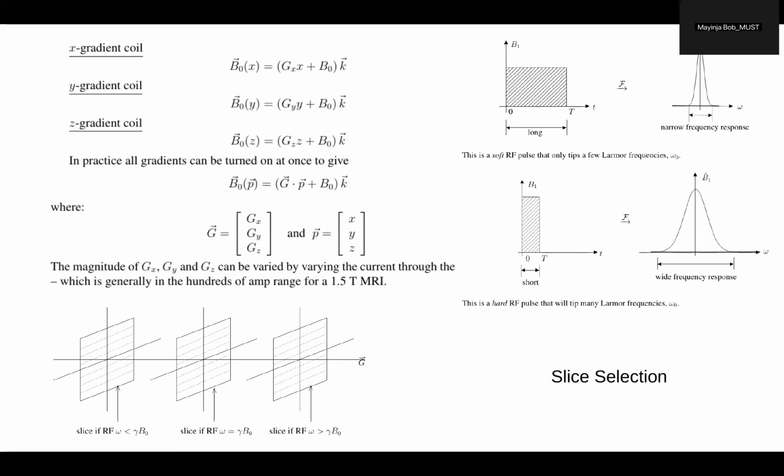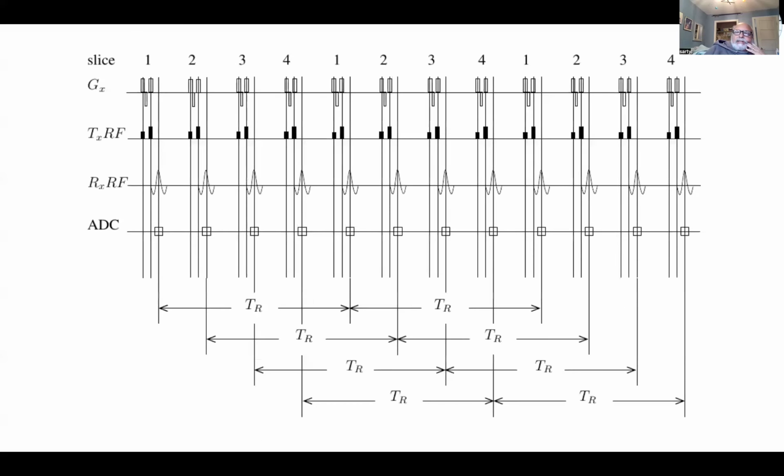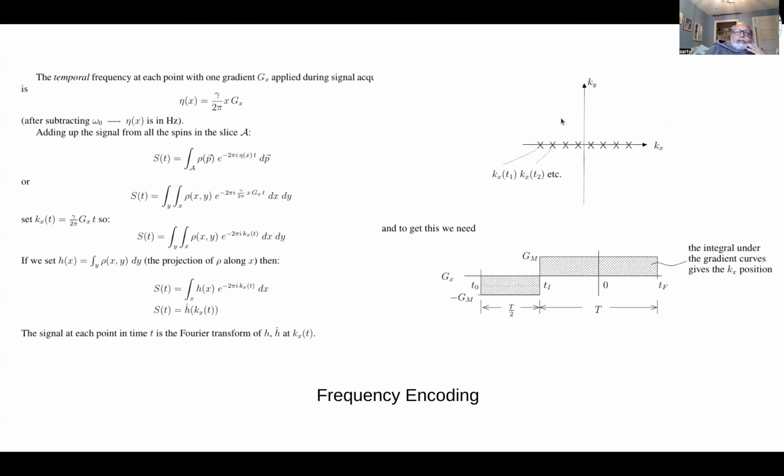Yes, it tries to. Okay, thanks. Yeah, I mean, you have to think about that. You really have to become comfortable with the Fourier transform to become proficient in MRI. There's no way around it because it shows up everywhere. So that's how it shows up with pulse sequences and what they excite. And here it shows up because we're doing a trick to turn temporal frequency into spatial frequency.